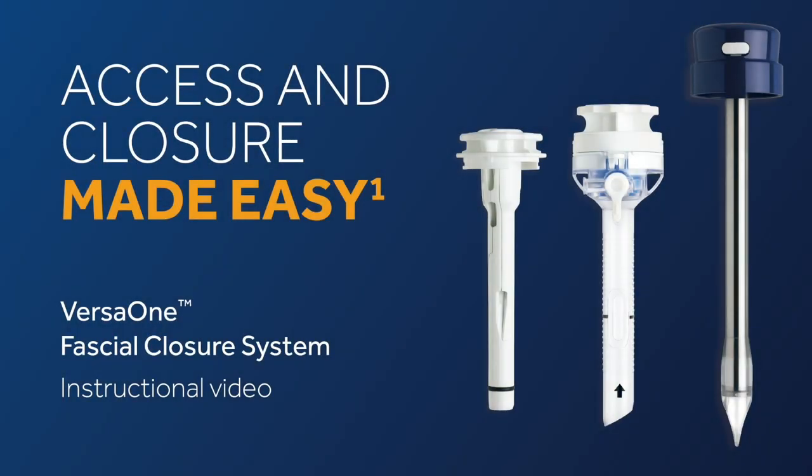Introducing the latest advancement in our VersaOne Trocar platform family: the VersaOne Fascial Closure System, an easy-to-use port site closure device that you can count on during laparoscopic procedures.